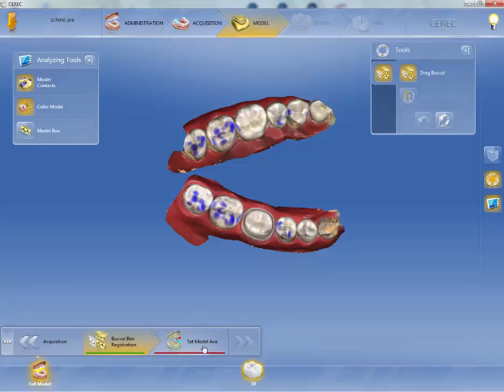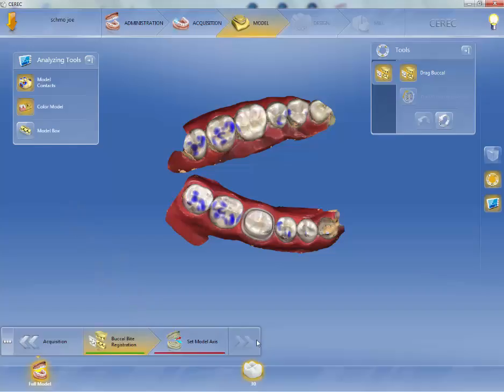So we're going to go to Set Model Axis. We're in the Step bar — it's red. Set Model Axis has not been started, and I can't go forward because it hasn't been highlighted. We're in the Model Phase, and we're in the Set Model Axis step. So I'm going to left-click on Set Model Axis.